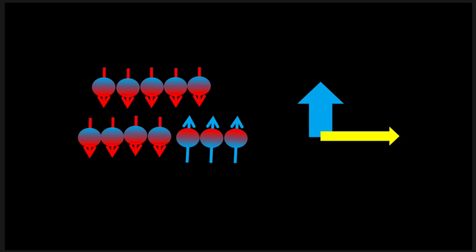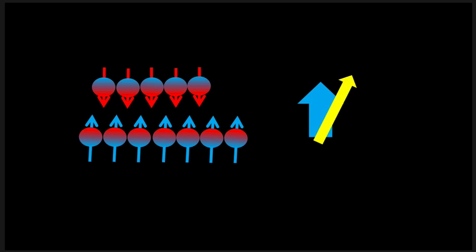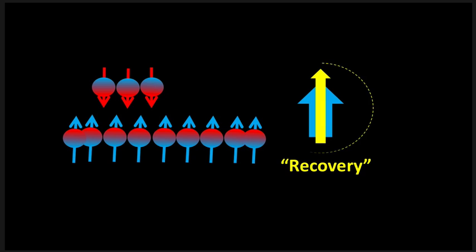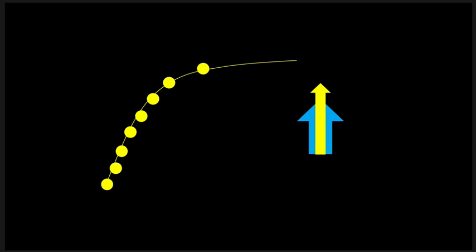Well, usually what happens is that it's a transfer of heat. Now, it's not a lot of heat. You're not cooking people in the magnet, right? But it's this energy transfer into the lattice. It gives off that energy as heat. And as it does that, you start to turn them more and more from that high energy state into the low energy state, and that is considered recovery. That's T1 recovery. And you'll see, it's graphed out like this typically, right?